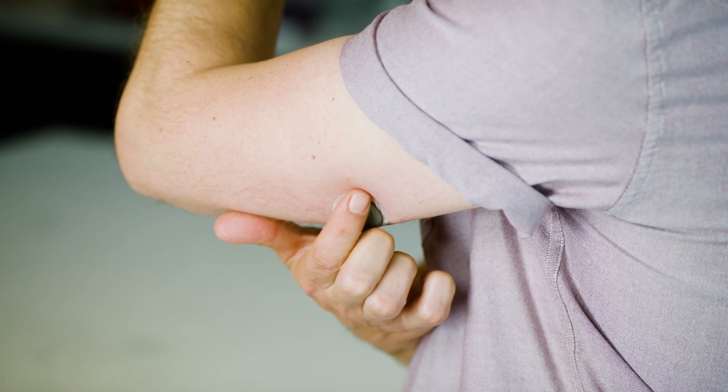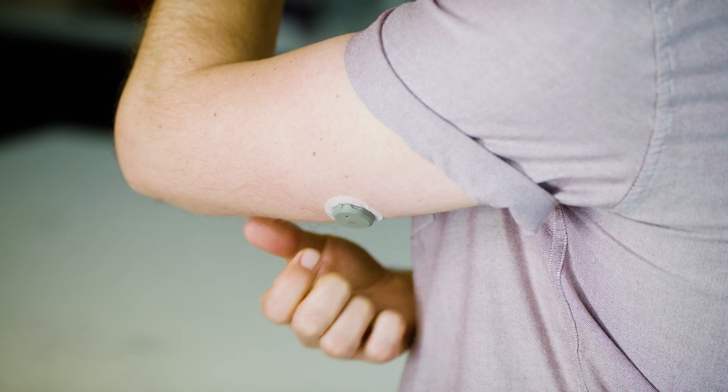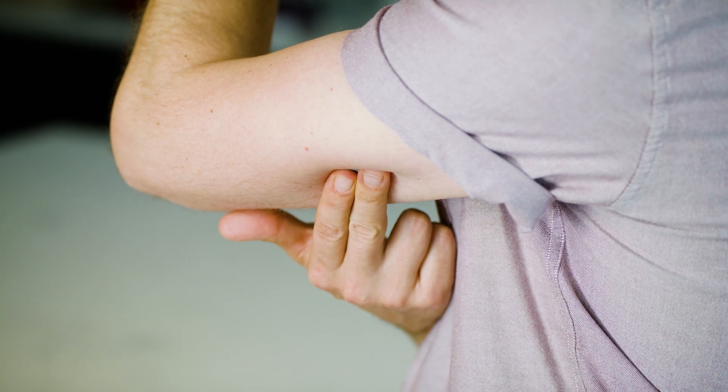To help keep the patch on your skin, rub around it three times. Then, press on the sensor for 10 seconds.